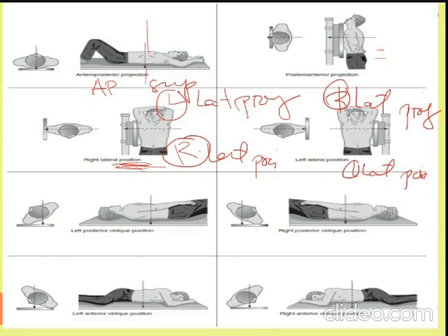This one, the patient is neither supine nor lateral. Therefore, this is an oblique position or oblique projection. What kind of oblique position is this?